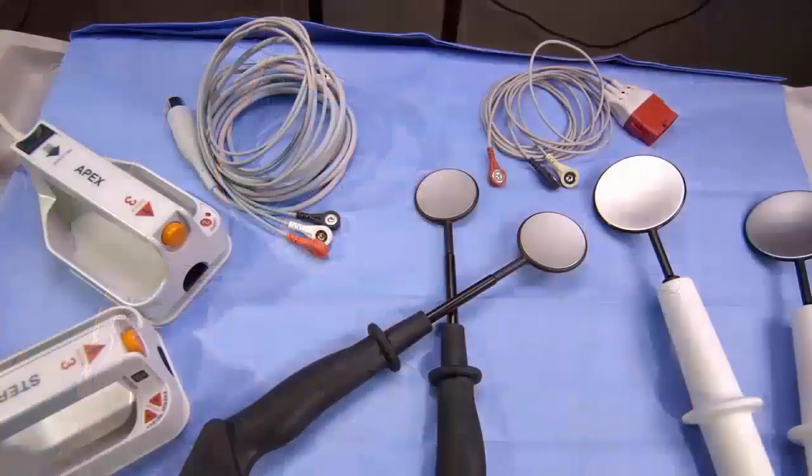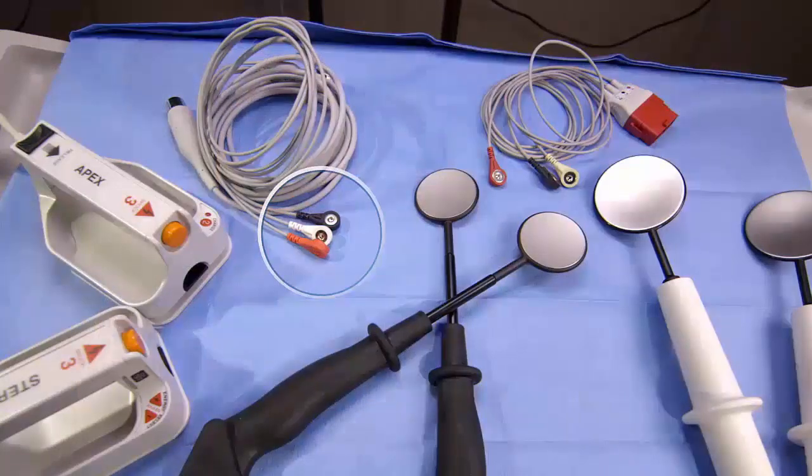If these electrodes are not used, you must first attach an ECG cable to the device and place the three lead ECG electrodes on the patient.